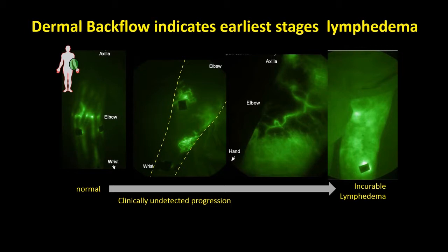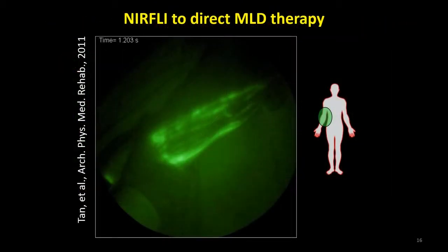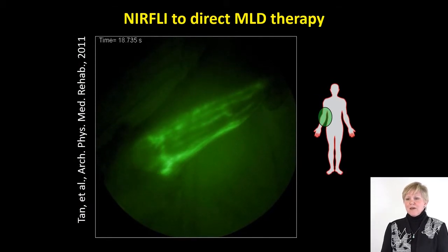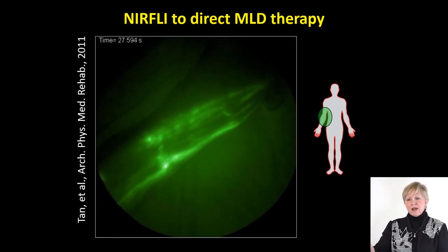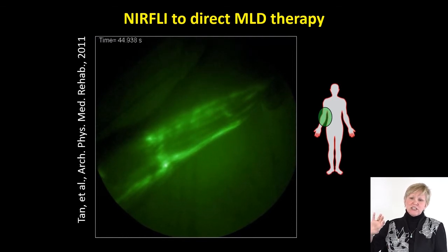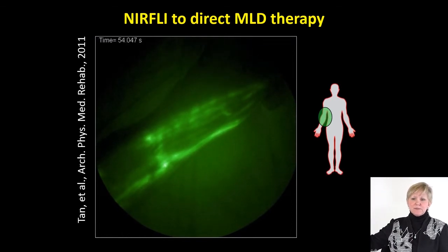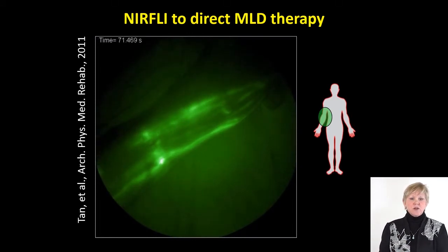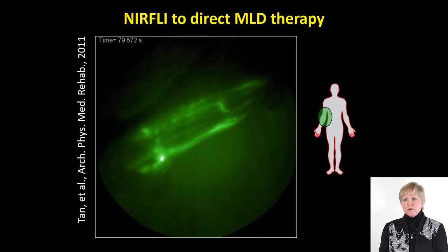And that's the tough time. It's very difficult for lymph to move extravascularly. That's why we have lymph vessels, so that we can move that lymph effectively through the vessels. The therapists who we've collaborated with have actually used the technology to help them direct manual lymphatic drainage. So we'll use Bluetooth technology, and we'll pipe the images onto a plasma screen on the clinic wall, and they'll watch that screen and perform their therapy by directing the lymph fluid to functional lymph vessels.